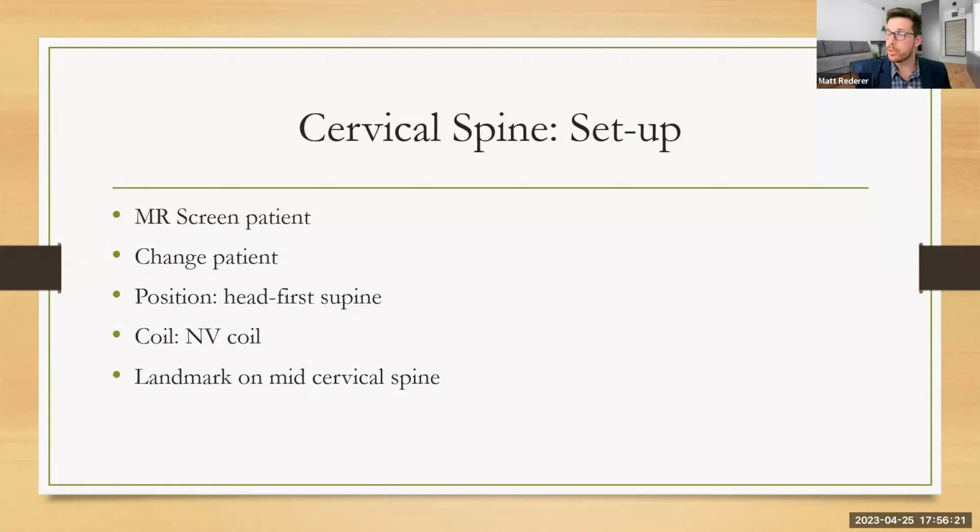Change our patient out of their street clothes, get them into position, head first, supine. We use what we call a neurovascular coil, or an NV coil.